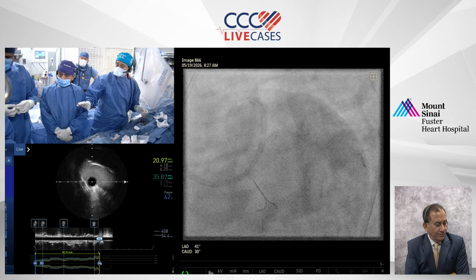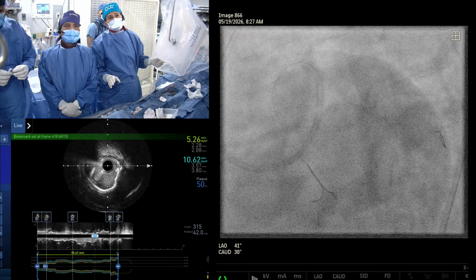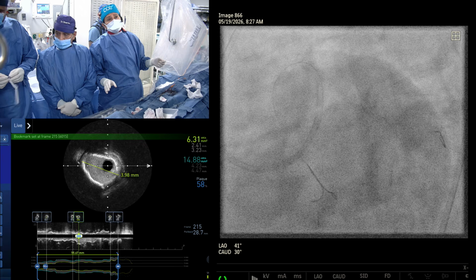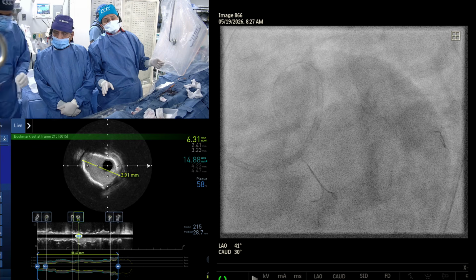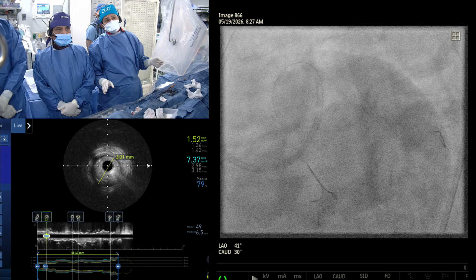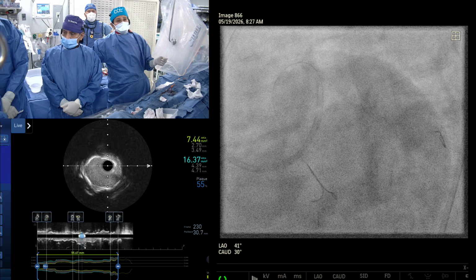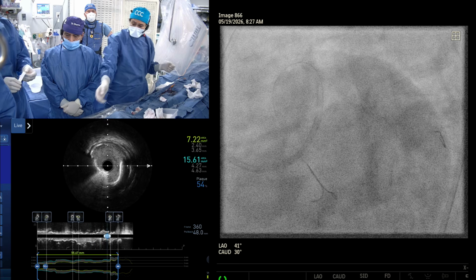3.5. Okay, hold on. No, go back. Give us a vessel size. 3.5 is okay, I think. We need 4.0? No, I think 3.5 is okay. Distal left main. Proximal LAD is not like 3.9, but mid to distal LAD is a 3.0 vessel. It's a tapering vessel. Okay, let's go 3.5 just because of true ostium. Okay, give me the IVUS. Let me quickly do that.